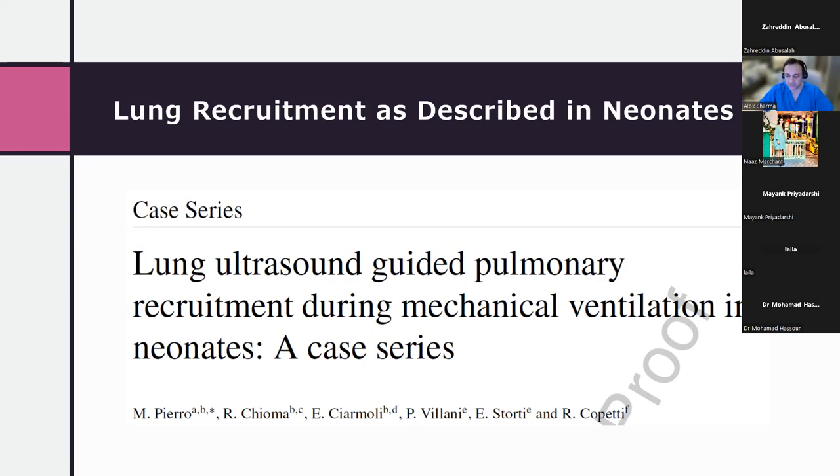Beautiful. So meconium aspiration, can I just give you an example? You might, on lung ultrasound, just have a B profile. You don't have any consolidation. You don't have any C profile. You don't have any atelectasis. But what you've got is a lot of interstitial pattern, B profile, a white out lung.